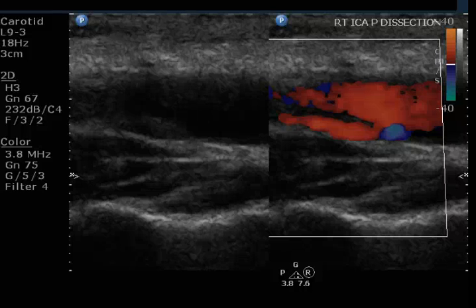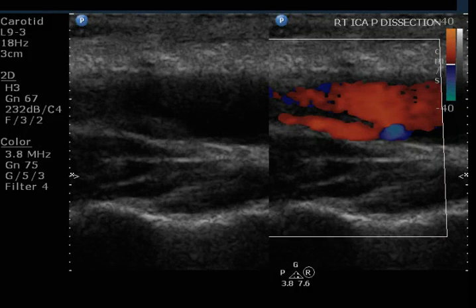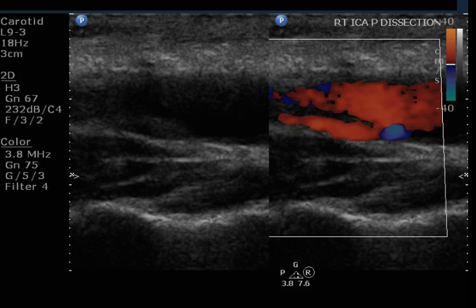This is an ultrasound study performed on the carotid arteries in a 39-year-old patient who is thought to have a carotid artery dissection.